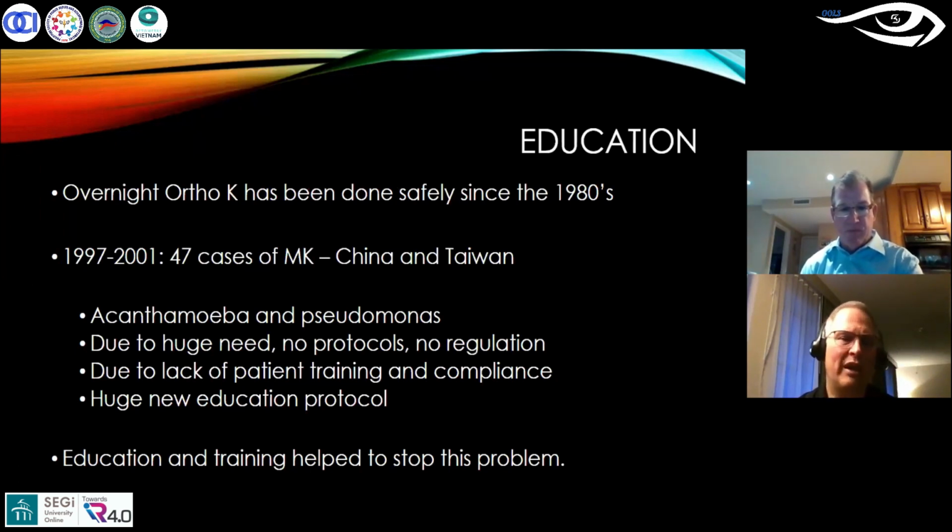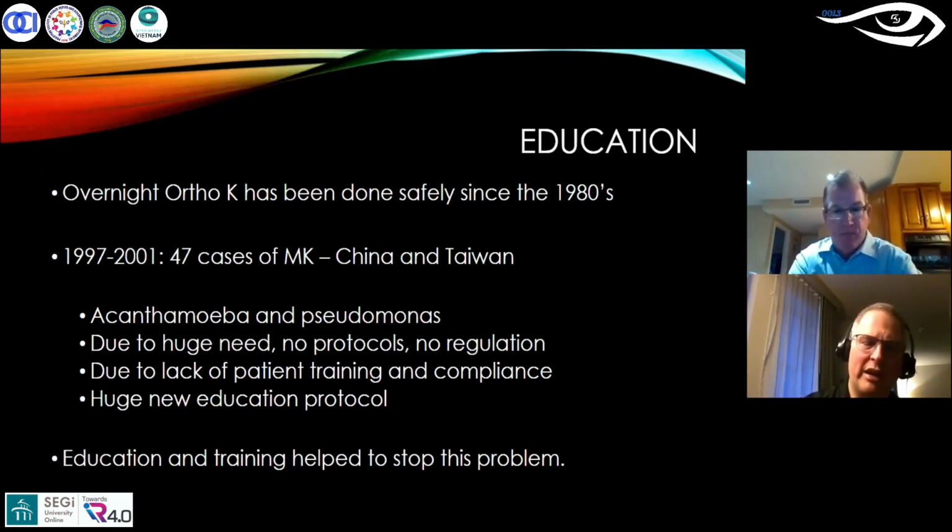But before we do, when I'm discussing Ortho K with patients, I'm very straightforward. I tell them people have been doing Ortho K since the 1980s, and that in the late 1990s and 2001, there was an outbreak of acanthamoeba in China, and that outbreak was associated with poor cleaning protocols. We'll talk about why that's important in just a moment.